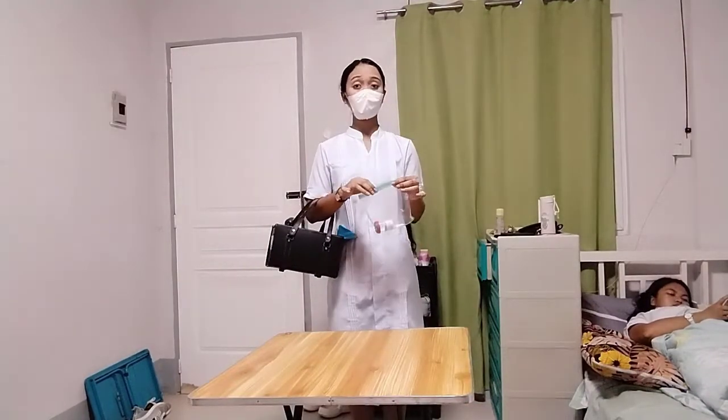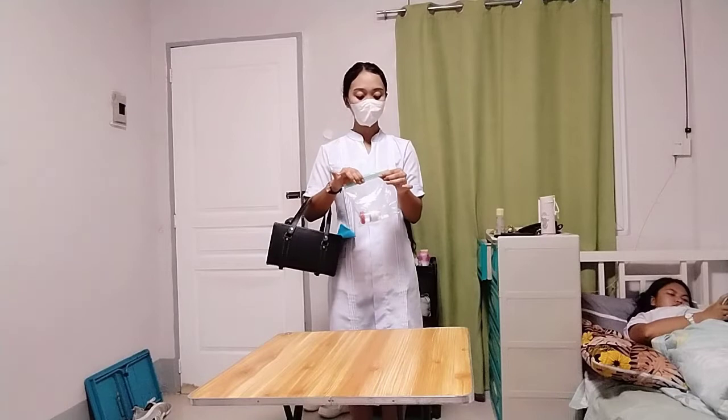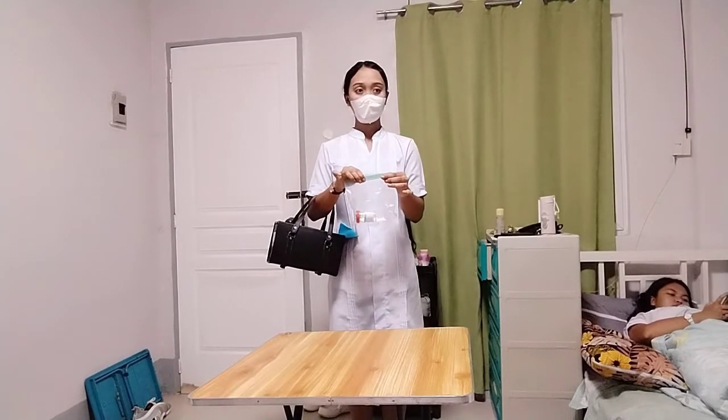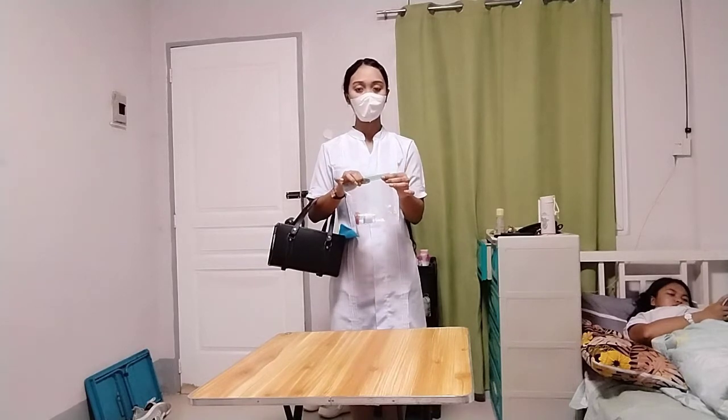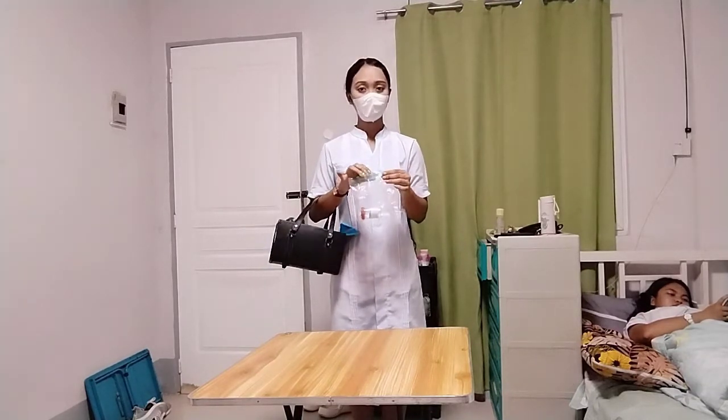So this is the sputum specimen. So we need to seal the biohazard bag properly and transport it immediately to the laboratory.